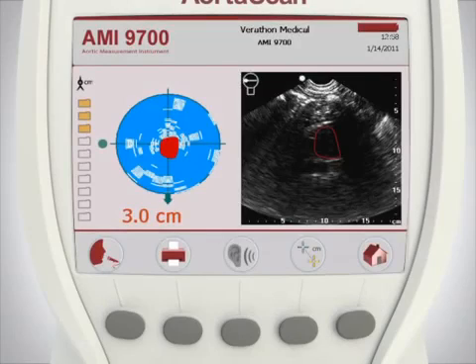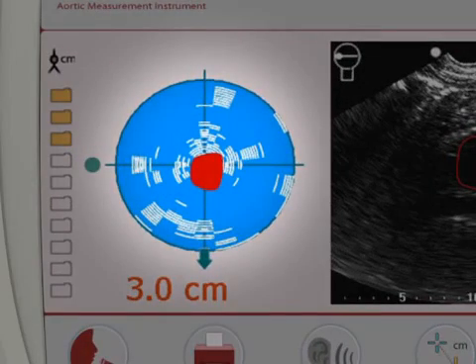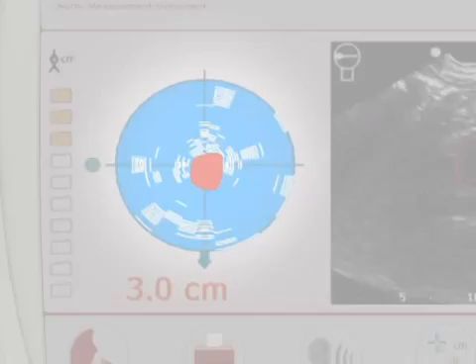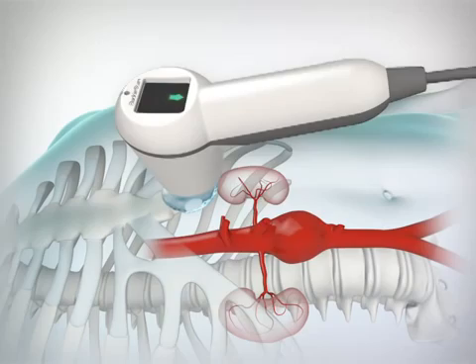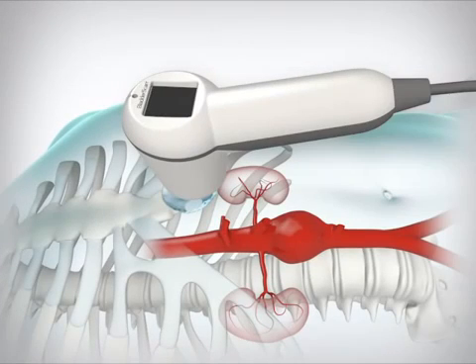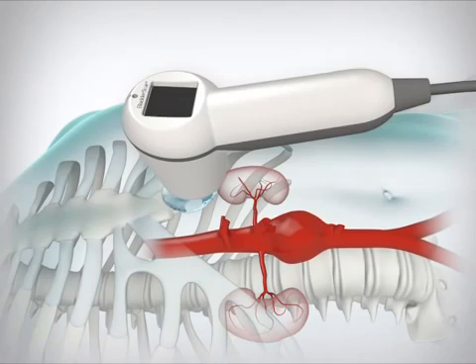If the scan is partially obstructed by bowel gas, the red aorta image will appear within the white lines on the aiming display. A green arrow on the console and a solid green arrow on the probe indicate the aorta can be detected, but the presence of bowel gas prevents an accurate measurement. Moving the probe 1 to 2 centimeters in the direction of the arrow has a high probability of providing a successful scan. Reposition the probe and re-scan, ensuring that the probe stays roughly on the midline of the abdomen. Gently working the probe into the tissues of the abdomen with a side-to-side rocking motion may help displace bowel gas shrouding the aorta.